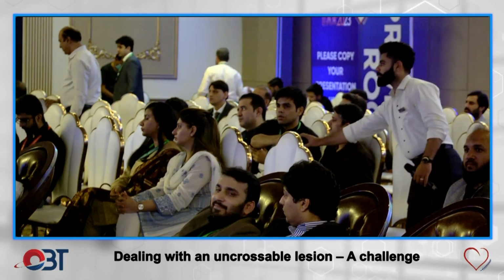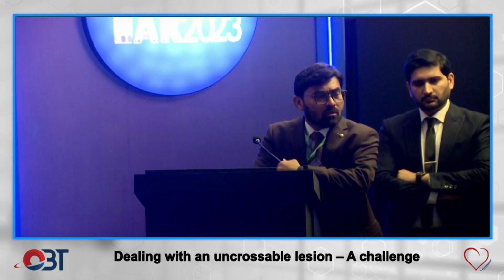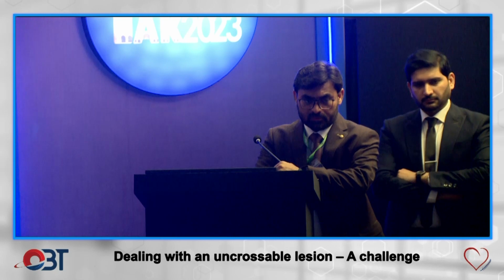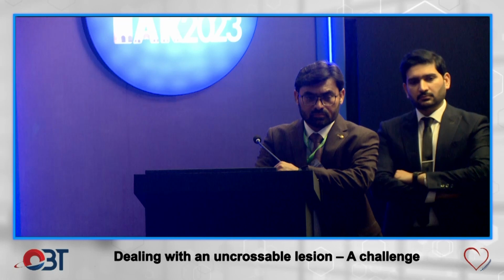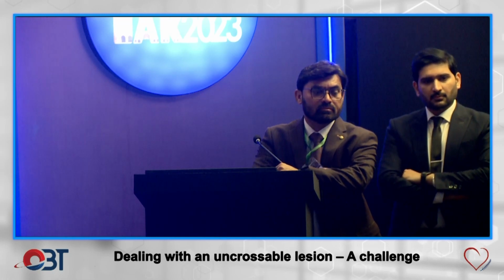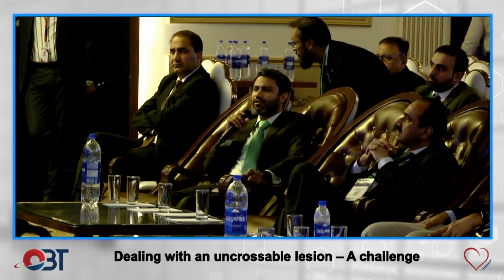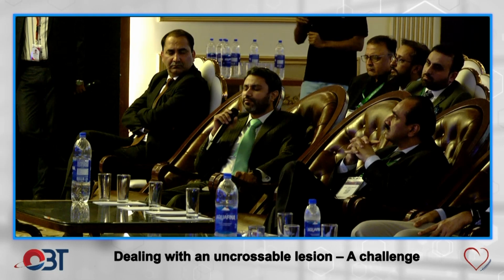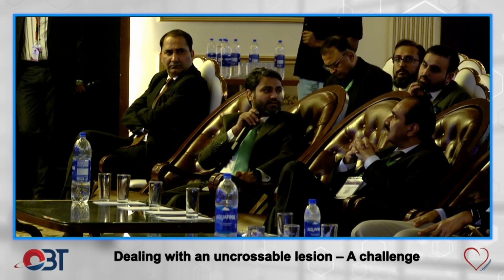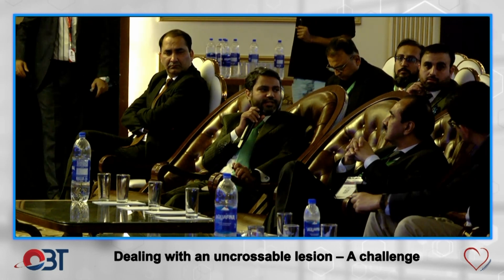I'm Dr. Ahmed Mukit. I was supervising this case with Dr. Junaid. Regarding the questions, even a 1.0 x 15 balloon was not crossing. And IVUS was highly unlikely to cross in this case beforehand. Obviously, it can be done after the stenting for further correction and further imaging-guided processing of the stenting. IVL was not available at that moment when we did the case.